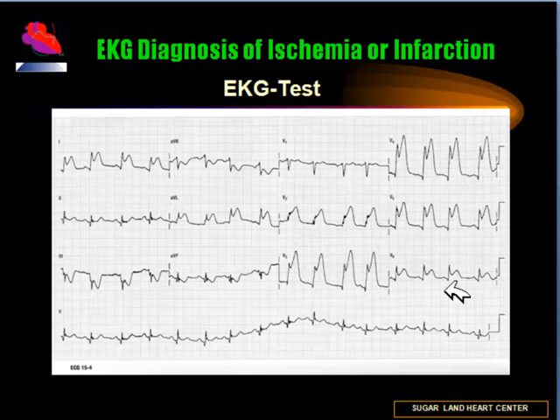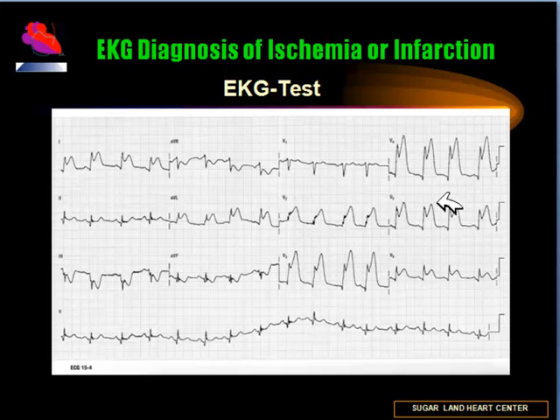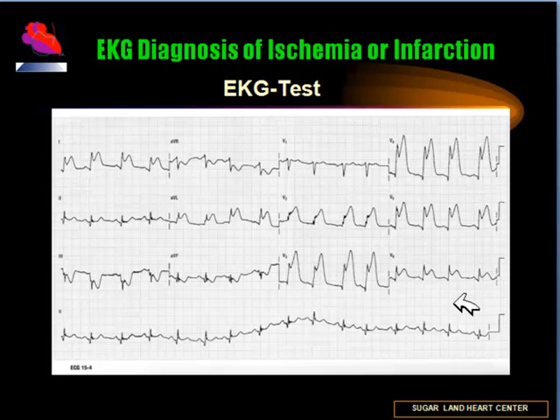We see ST elevation in leads 1 and AVL, representing the high anterior wall related to the proximal diagonal branches. We have anteroseptal myocardial infarction involving V1 to V4, representing the main septal and diagonal branches. Then we have the lateral wall represented by V5, related to the distal diagonal branch. This is what is known as extensive anteroseptal myocardial infarction.